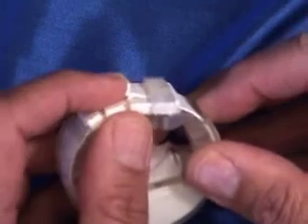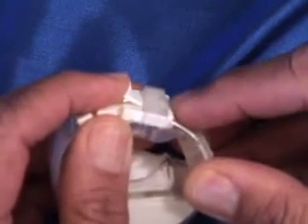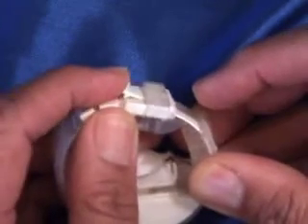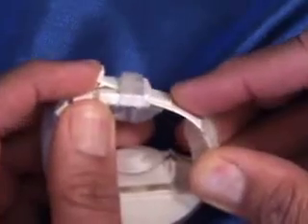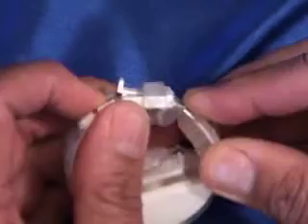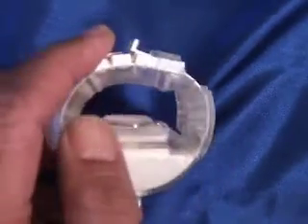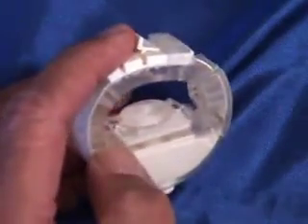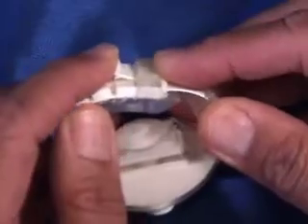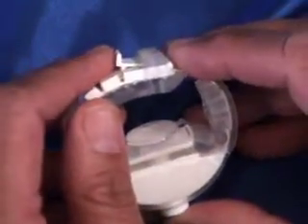Do not elevate the elevator tab excessively, otherwise it can damage the locking mechanism. Just very gentle pressure is required to release the strap as demonstrated here, and the device can be easily secured. The device should not be left on for extended periods. It is also necessary to release the device periodically to relieve pressure on the penis for circulation.